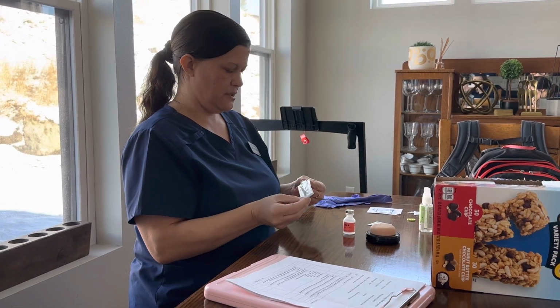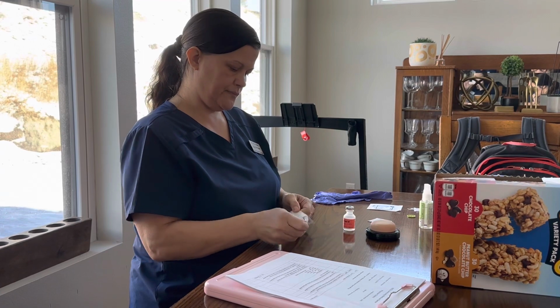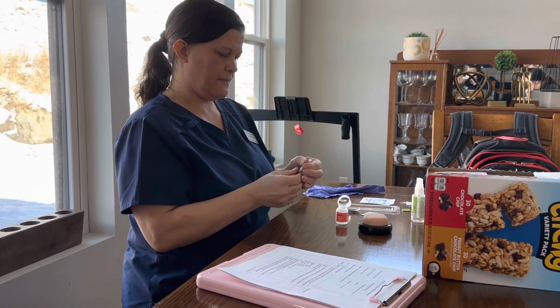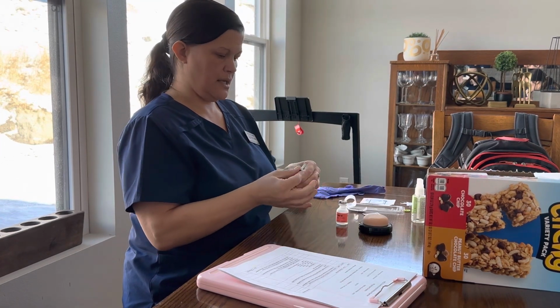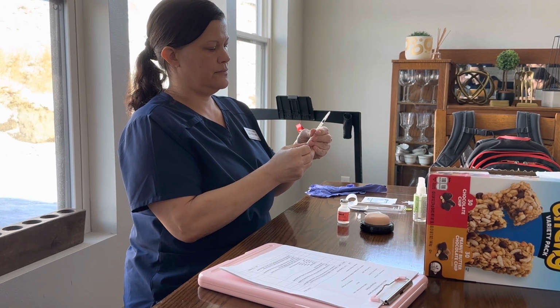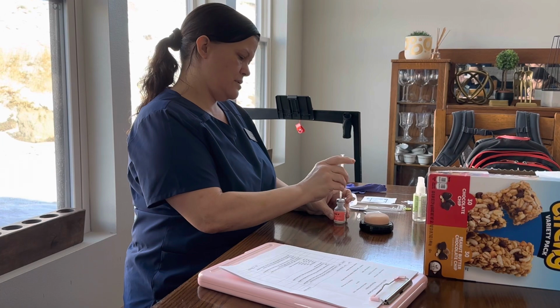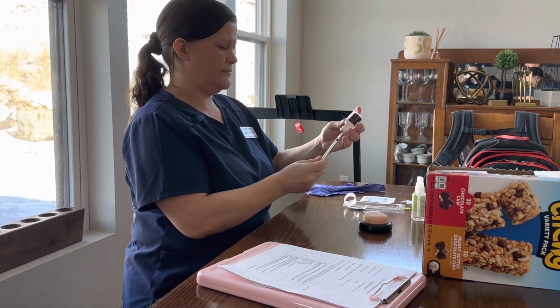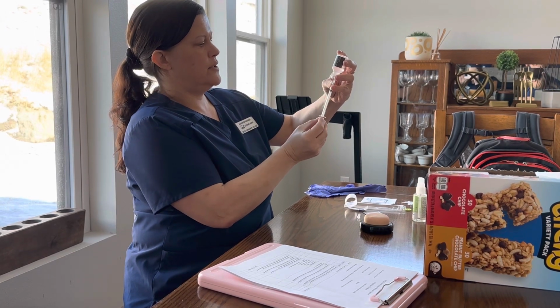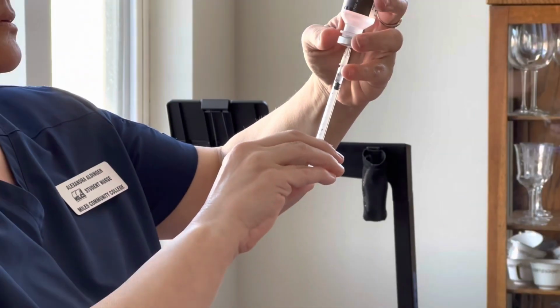and I'm going to go ahead and grab my needle, which is the 1 ml needle, and I'm going to remove the cap, and I'm going to withdraw 0.1 mLs, and then I'm going to inject that into the center of the stopper. Invert the vial, and I'm going to withdraw 0.1 mLs.